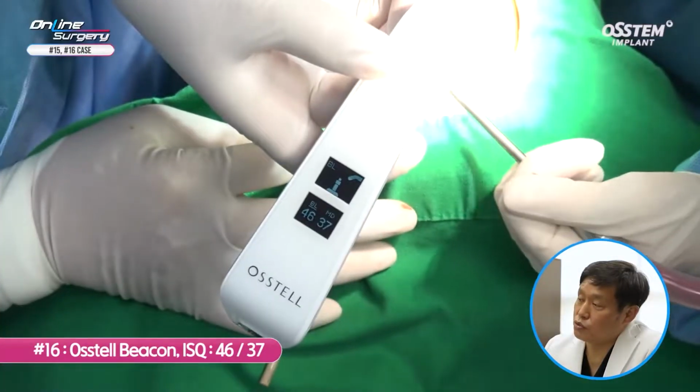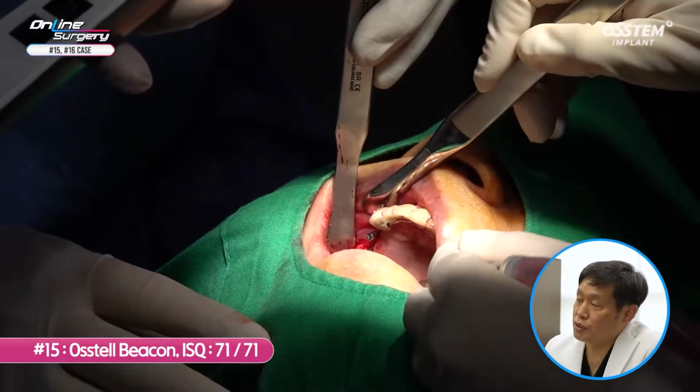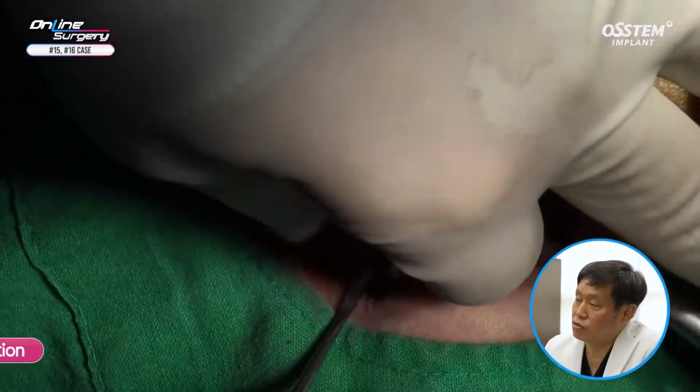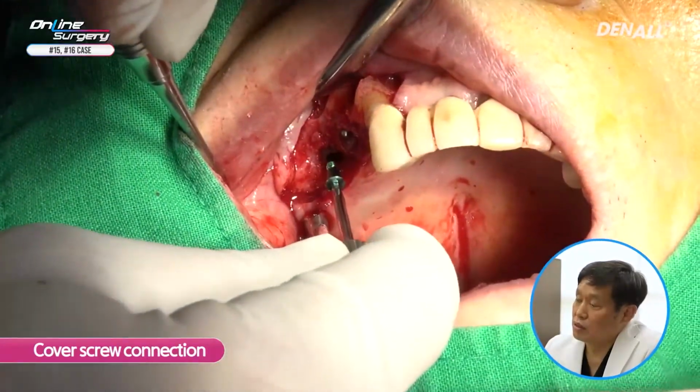ISQ value is taken. In the case of number 16, primary stability is lacking, it's 46. In the case of number 15, it's 71. This is the ISQ value. Cover screw is connected.